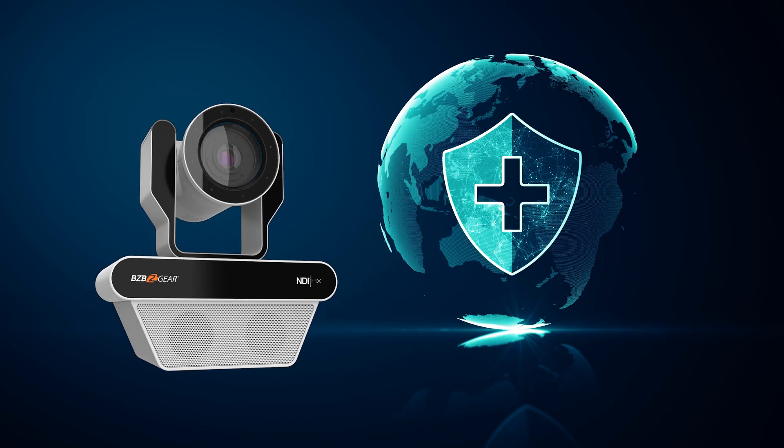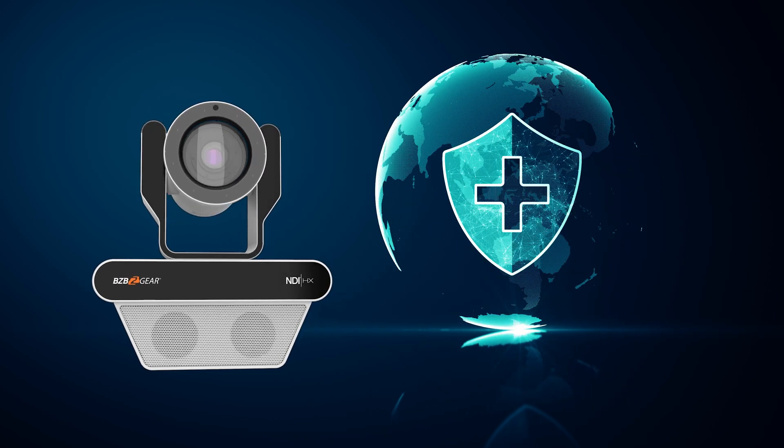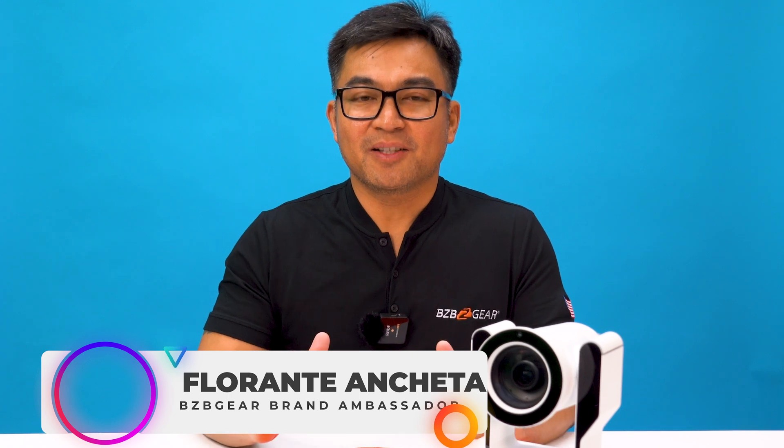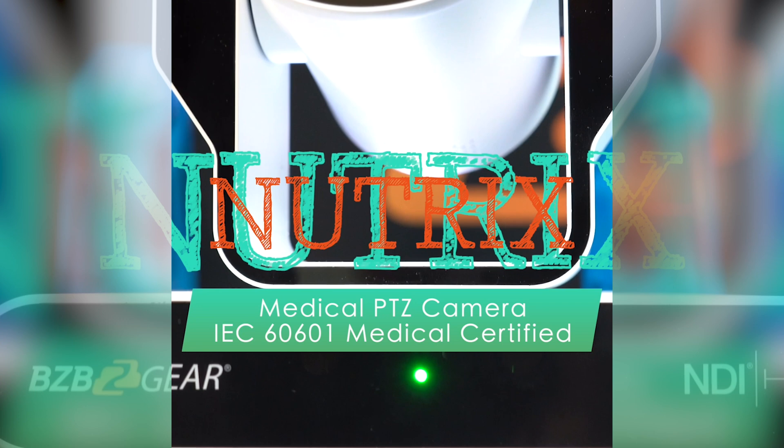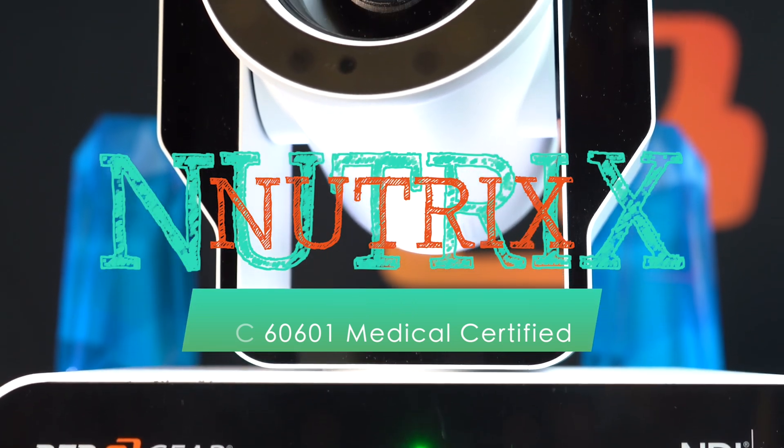In the world of healthcare, precision and reliability are not just requirements, they are necessities. Introducing the BG Nutrix, a medical-grade camera that redefines patient care and monitoring.